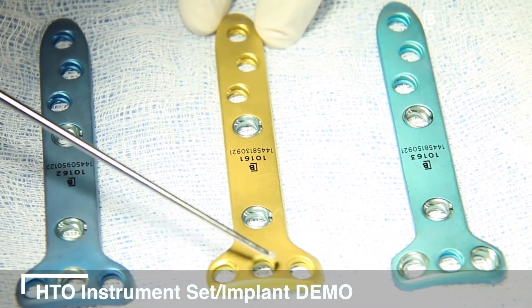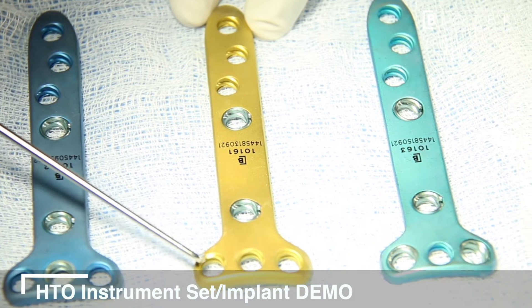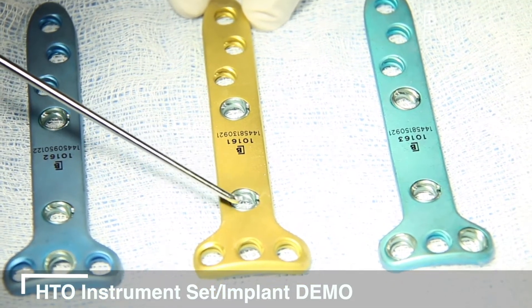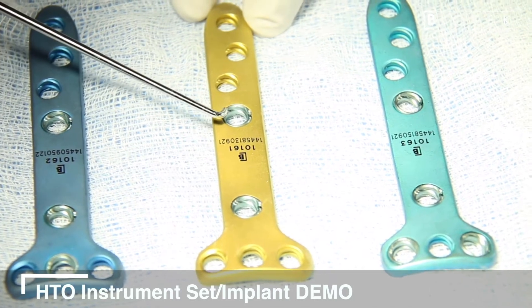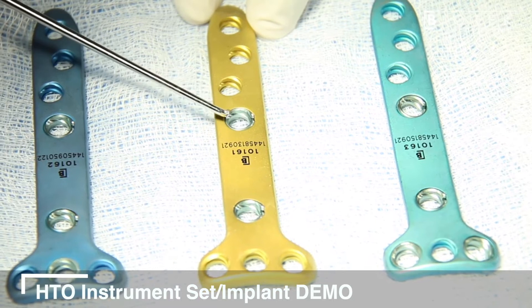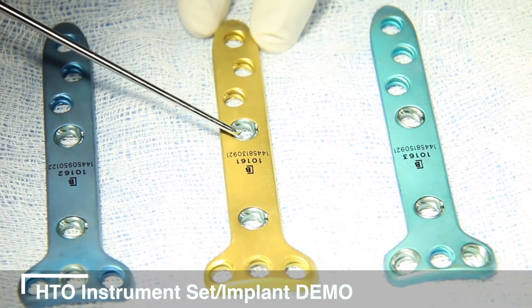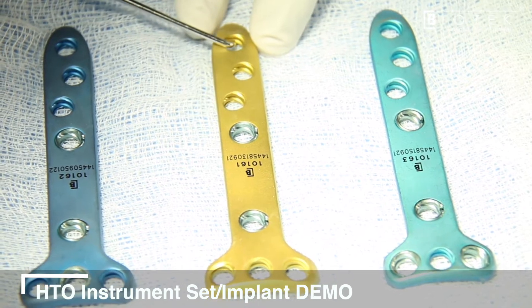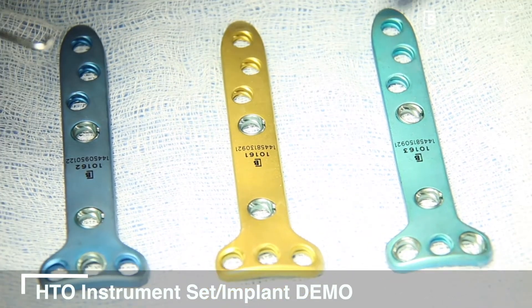These are locking holes, but the D hole is a variable angle locking hole. Similarly, for the distal segment, hole number one — the most proximal hole — is also variable angle, while holes two, three, and four are fixed angle.